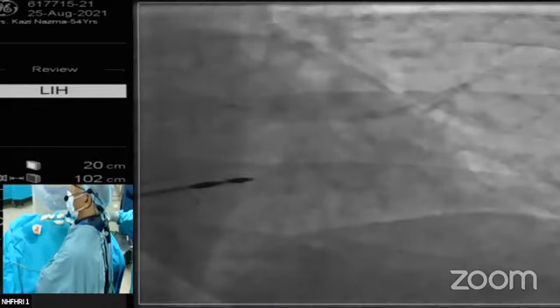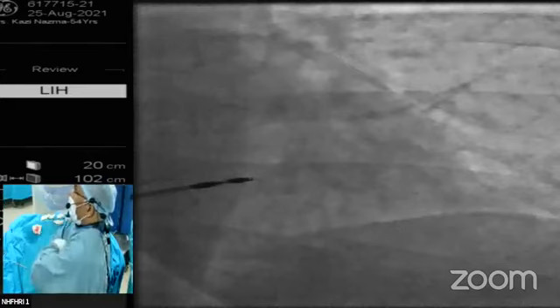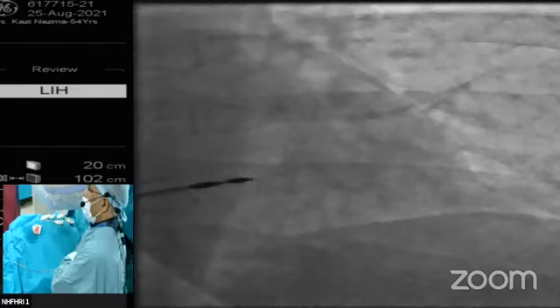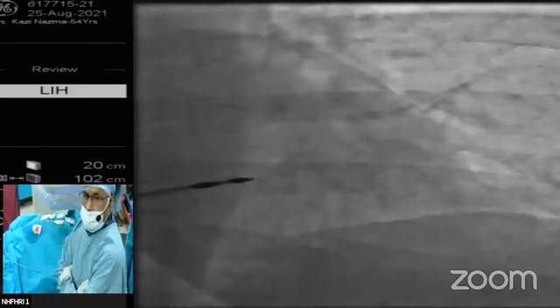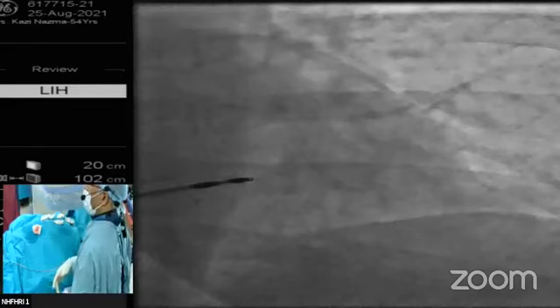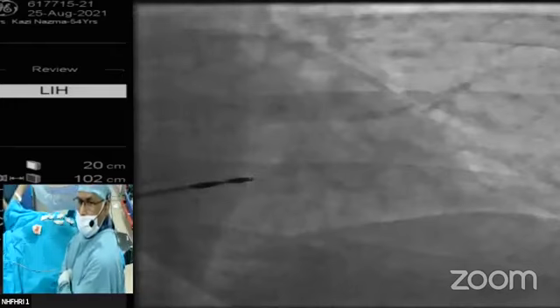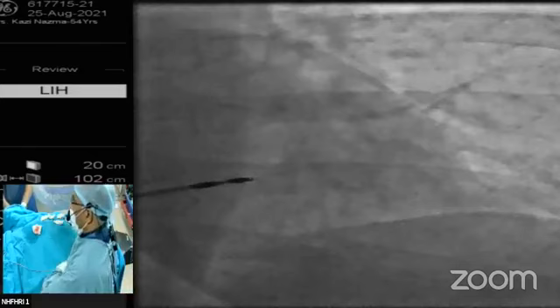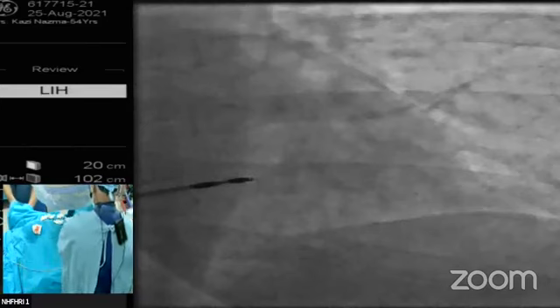The advantage: RV apical pacing will produce LBBB-type ECG, and it is monitored on the ECG monitor. RV apical pacing produces LBBB and LV-induced dyssynchrony, and it is said that LV function may deteriorate. In septal pacing, the RV QRS complex is a little bit narrower, so there is less chance of LV deterioration and dyssynchrony.